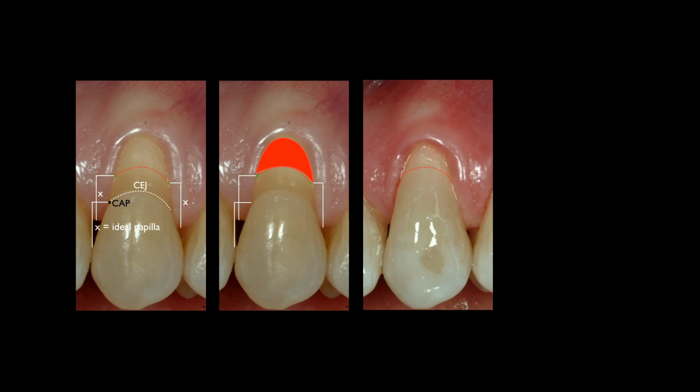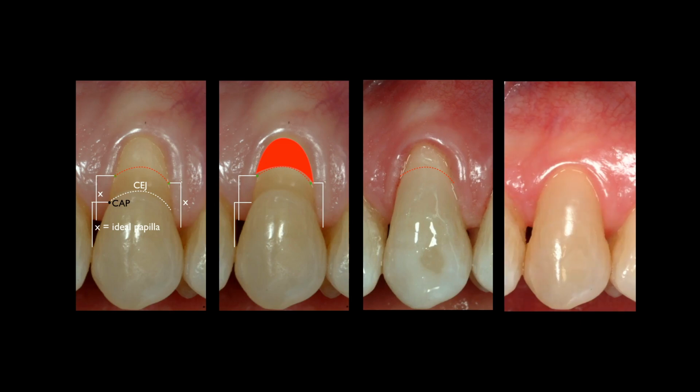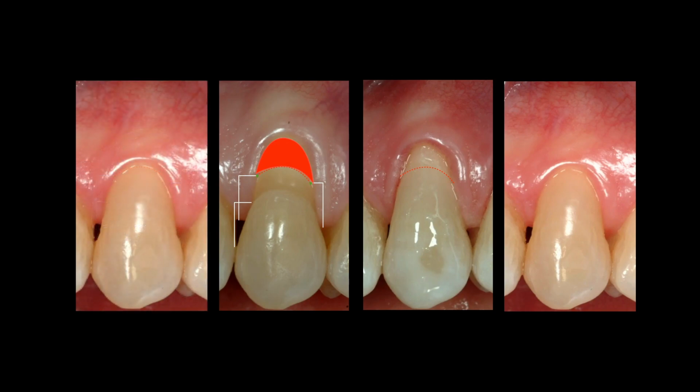And now you can use your keratinized tissue to be well adapted above the very convex, clean, smooth surface, and so a good aesthetic outcome will be achieved by the patient, even if this was not exactly what the patient expected before surgery, because it is really more apical, about 1.5 to 2 millimeters more apical. That is how much papilla, bone, and attachment was lost.